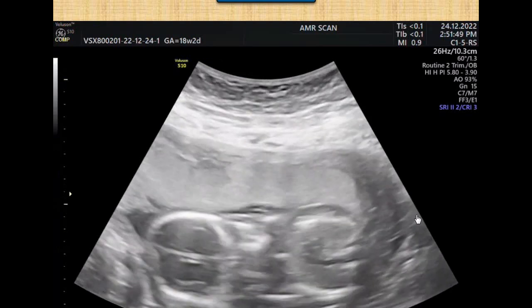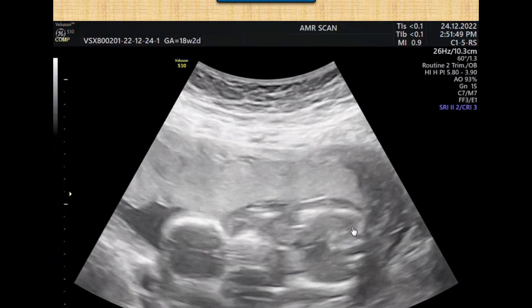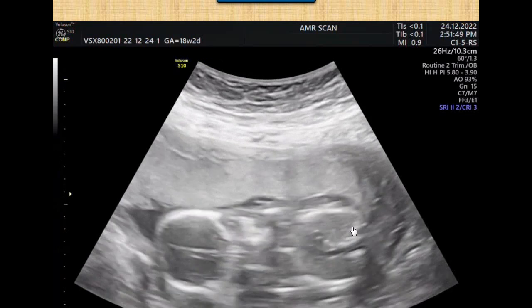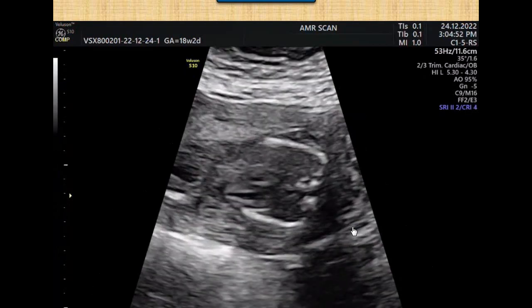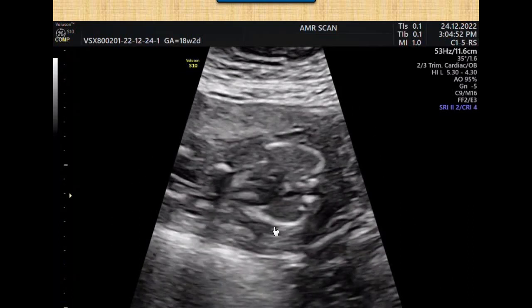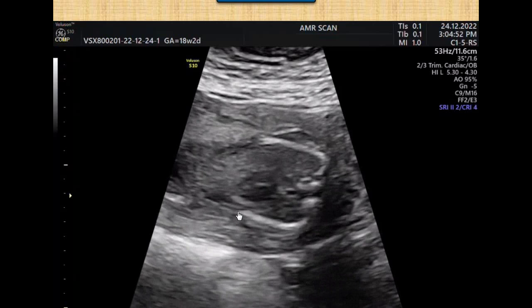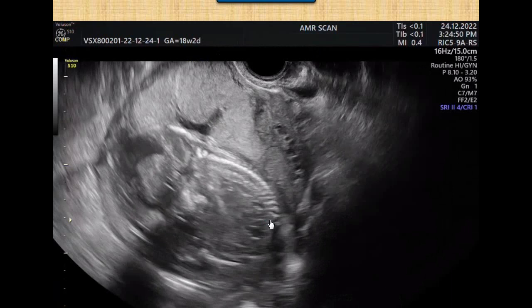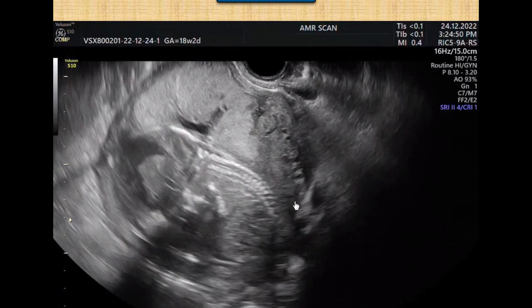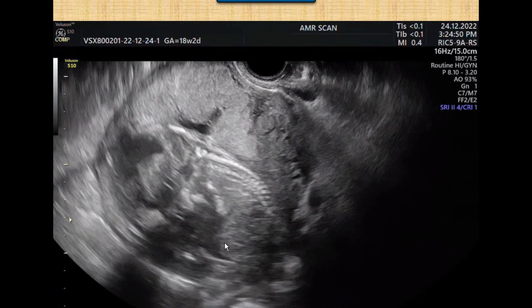The fetal kidneys are significantly enlarged and polycystic. And the ribs are significantly short. A normal rib will reach to the apex of the heart. This rib is markedly declining beyond the level of the apex of the heart. And on a profile view of the fetus, you will notice that the chest is small, bell-shaped compared with the fetal abdomen.